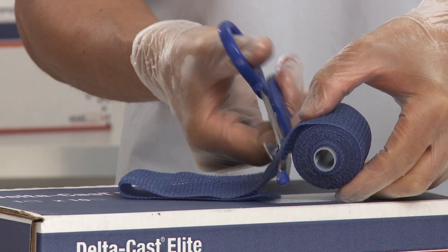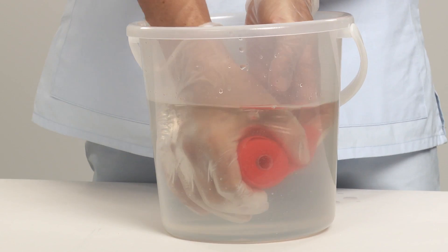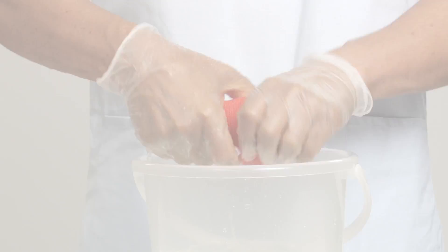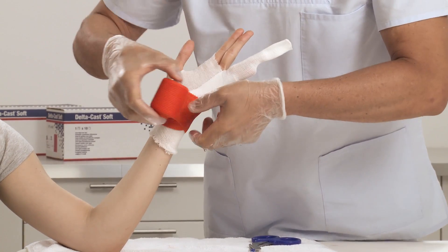If stronger reinforcement is required, increase the number of layers. Select the appropriate width of cast tape depending on the size of the limb. Activate Deltacast Soft by squeezing it once within and once gently out of the water to drain any surplus liquid out of the bandage.